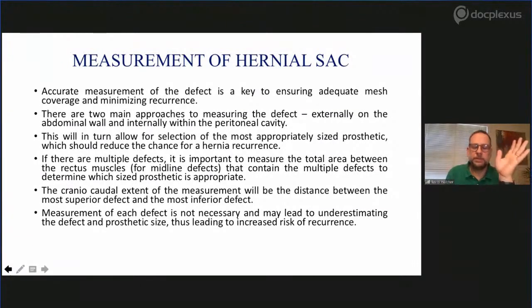As was said, obesity is a big issue. Right now in my practice, the mean BMI of a person that lives in the Bronx is 37. So obesity is a real big problem in my practice, and I need to rely on the intracorporeal measurement. I always use a ruler.